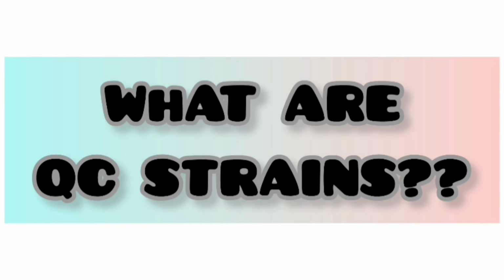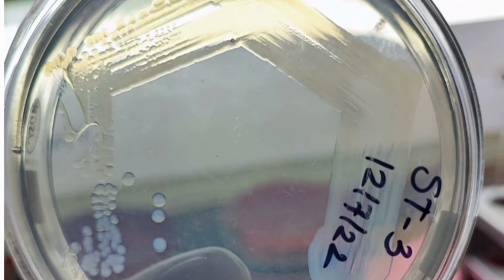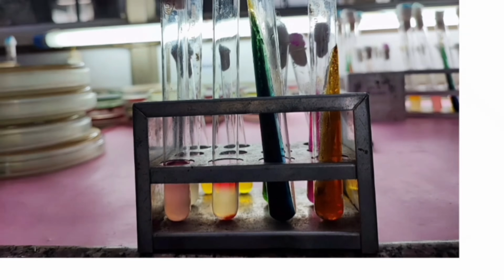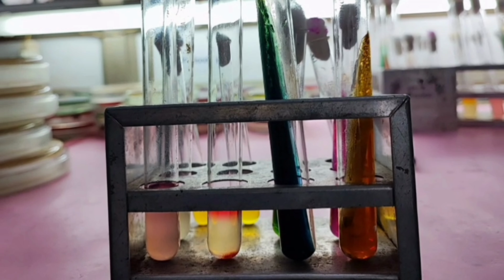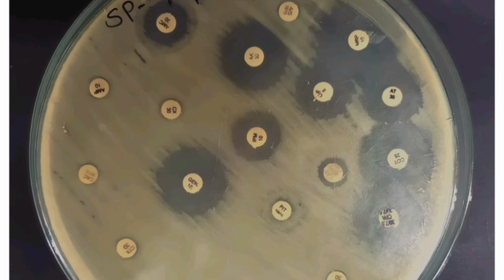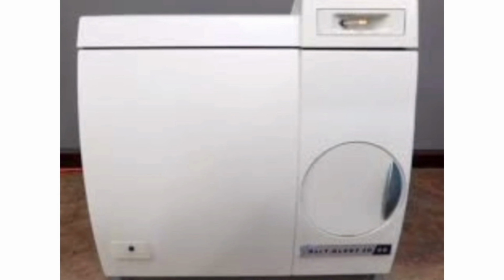First of all, let's discuss what QC strains are. The QC strains are standard reference microorganisms with known characteristics. They help us verify whether the media is working properly, the biochemical tests are performing correctly, the antibiotic susceptibility discs are accurate, the strains and reagents are functioning, and the instruments are reliable. These strains act like internal controls for the lab.